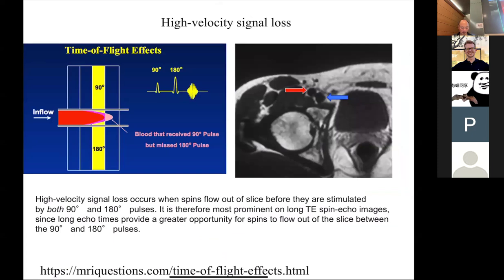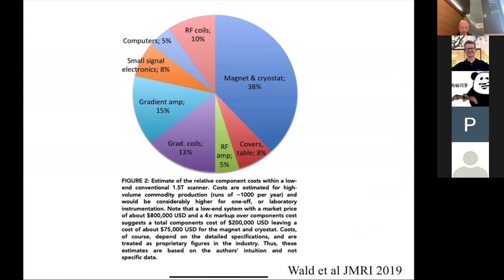And yeah, so let's skip over that one for today. Okay. So what we're going to do is end now. Any questions on that? So that's just sort of introducing you to the idea that there are ways of measuring flow, and two of the most common ones are using phase or this time of flight. Okay. Is there a question?